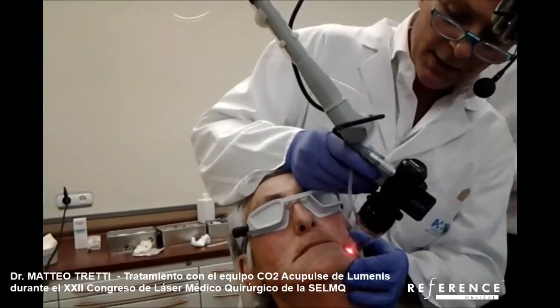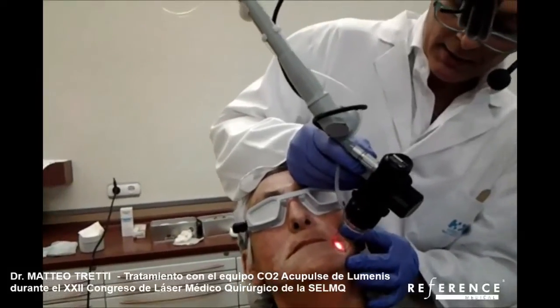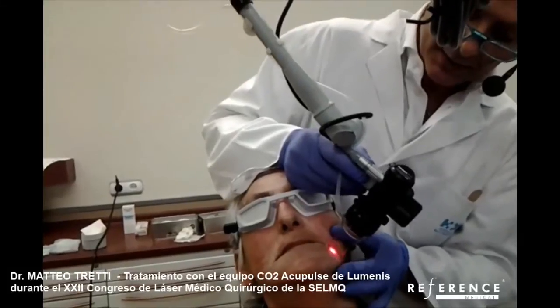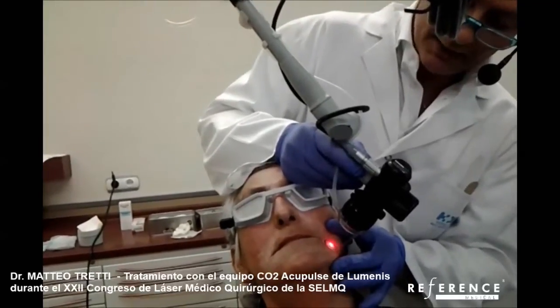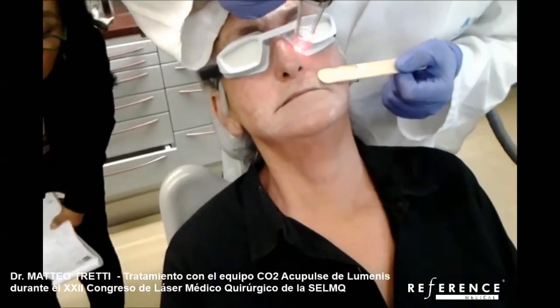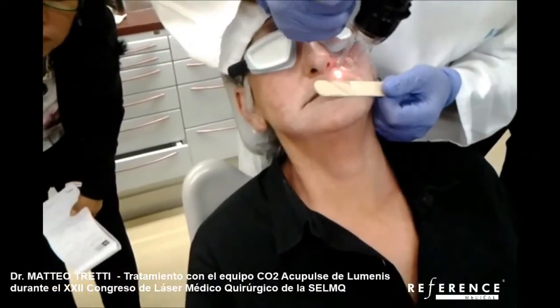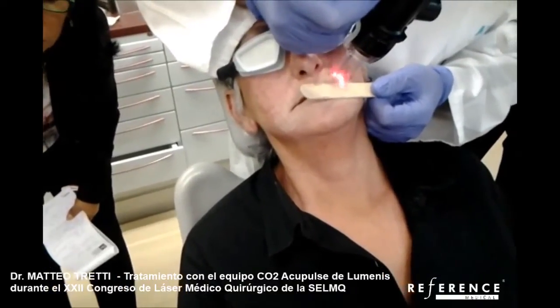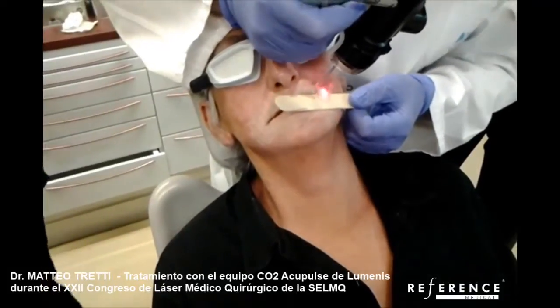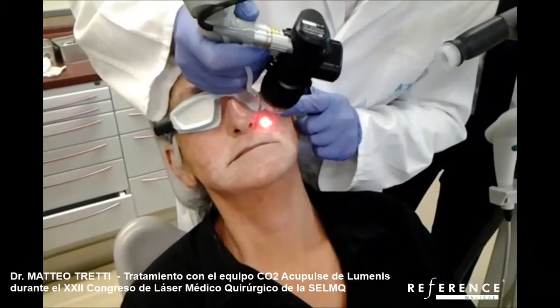I go just a little slower — deep, superficial. Deep and superficial. Probably here it is clear, though I don't know with the camera. We have a pinpoint bleeding there, and this is a very important hallmark to understand if you are doing a good job or not, because this is a clear sign of where you are working.